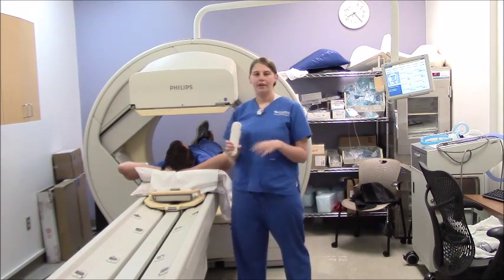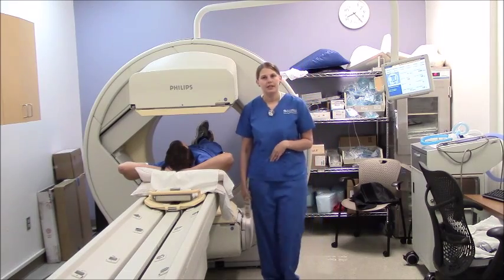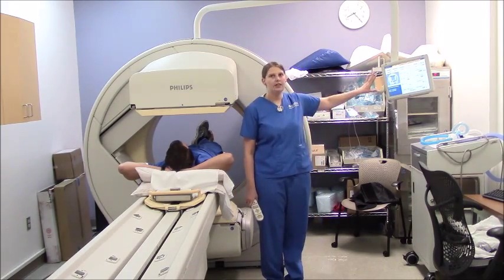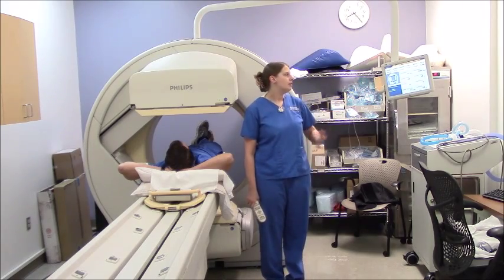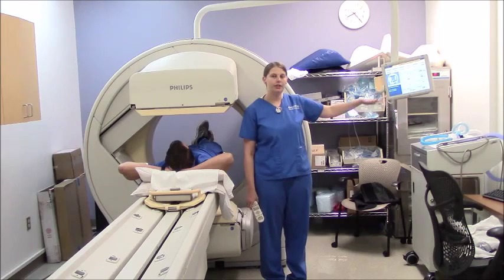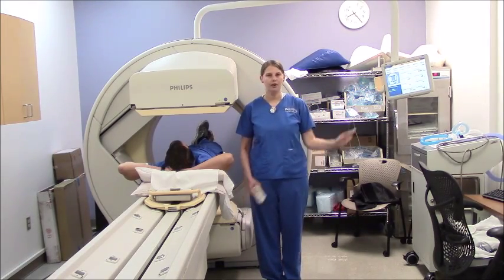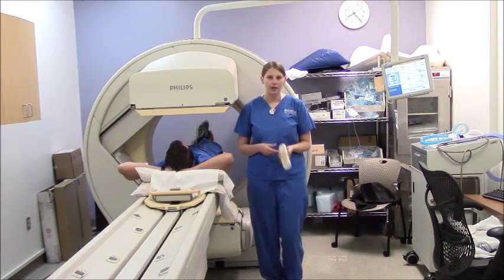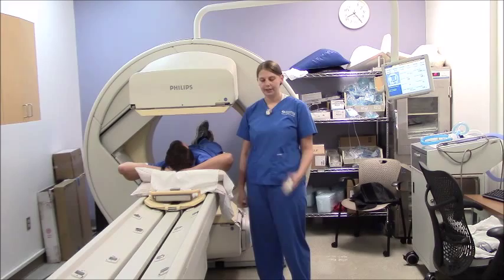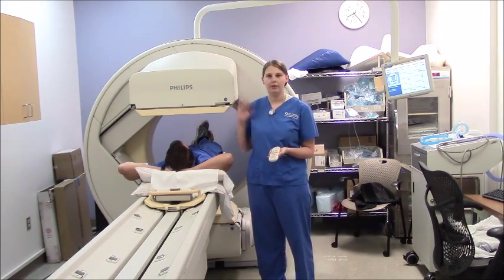Okay, so I've got my patient in position. This is a little bit easier than the ventilation portion because they are already injected. You will be able to see their lungs on the screen. So on your P-scope, you just want to make sure that you have all of the lungs included in your field of view. You don't want to cut off the top or the bottom or either side. Now the first picture we take is of the front and the back. So you want to get the camera heads as close as you can to get a real good picture.